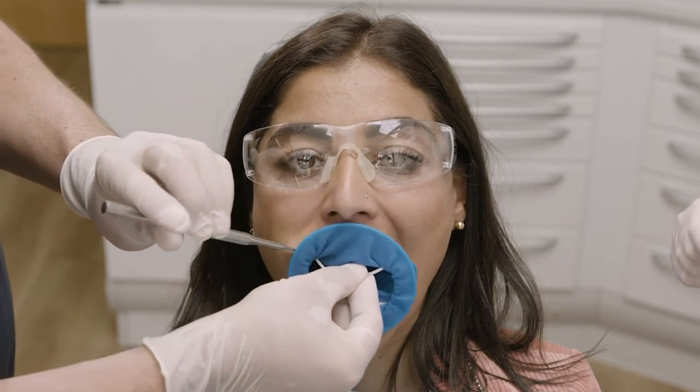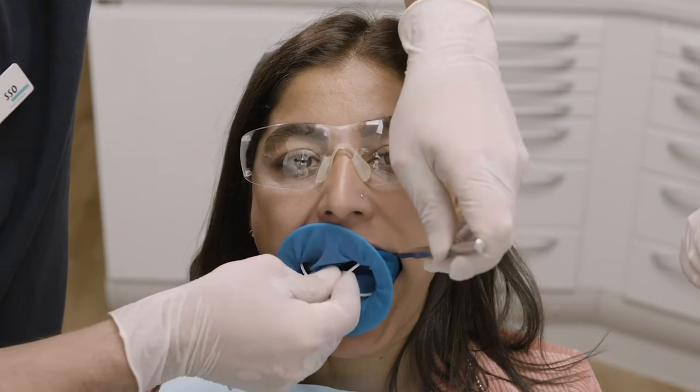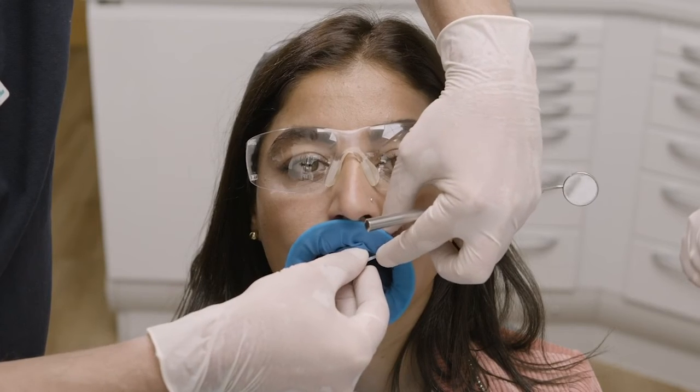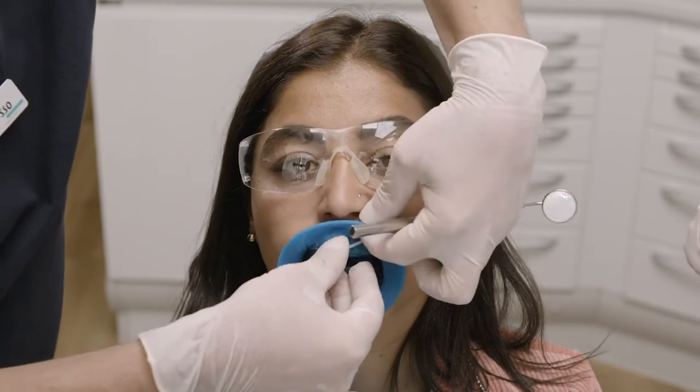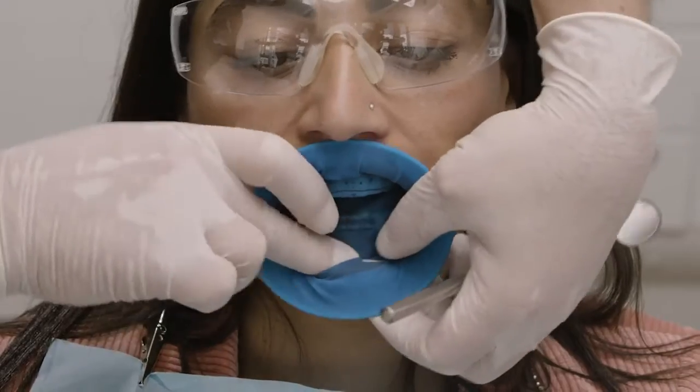Optradam can also be used for the anterior region without clamps. The individually punched holes ensure that the dam is optimally stretched for proper tooth isolation. Secure Optradam cervically and pull it towards the oral aspect.